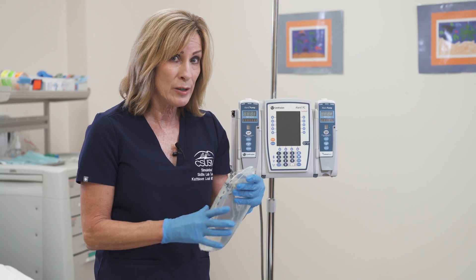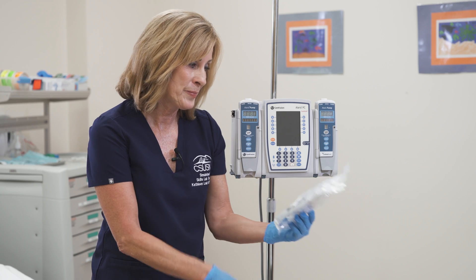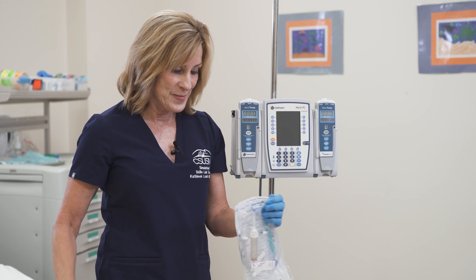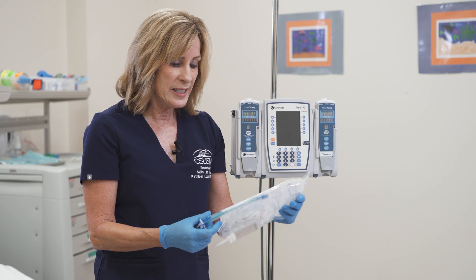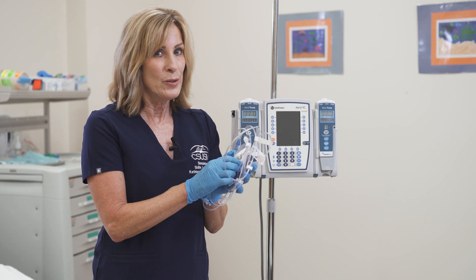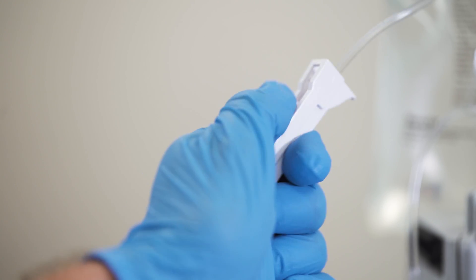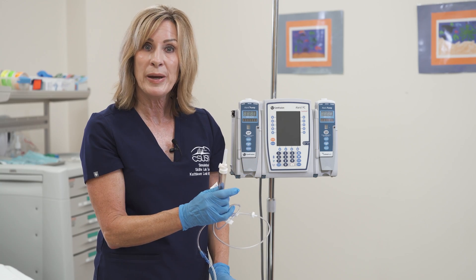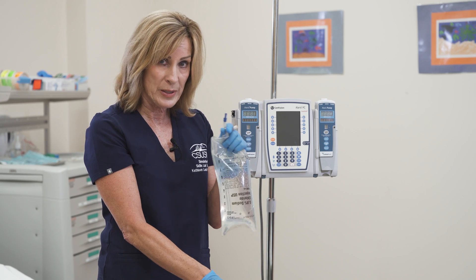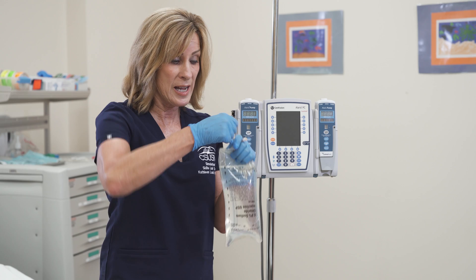First I'm going to select my Laris primary tubing and open it. When I take it out I'm going to note that the clamp is open, and you always want to go ahead and close your clamp. There are a couple different ways of spiking a bag. Right now we're going to spike it by simply holding the bag and pulling the tab off.